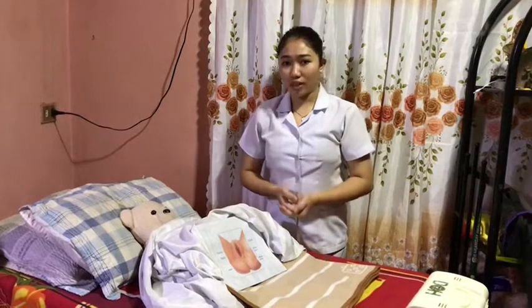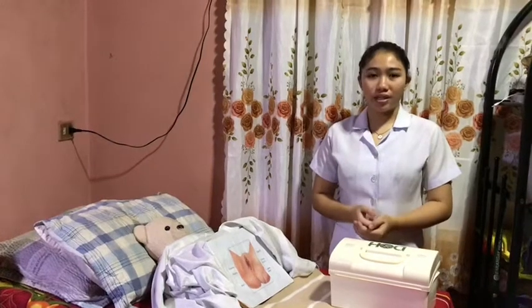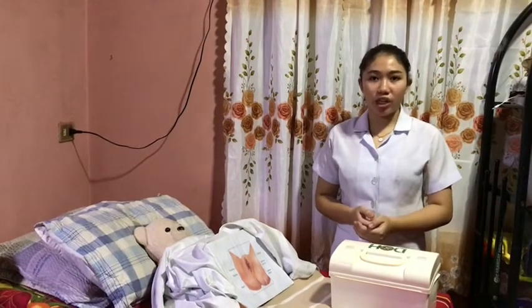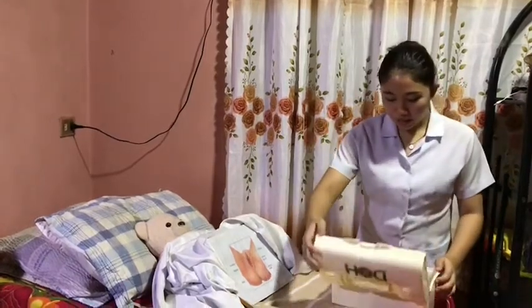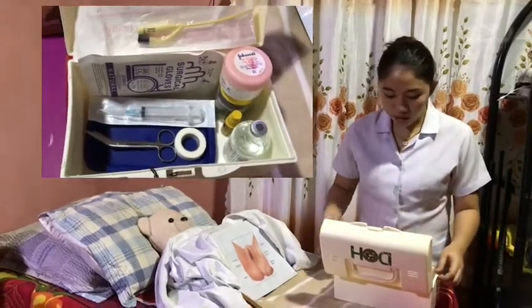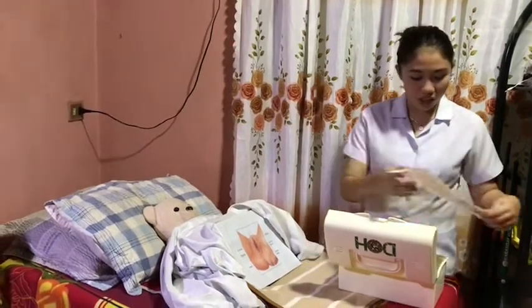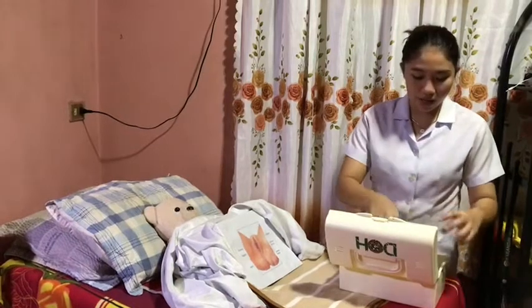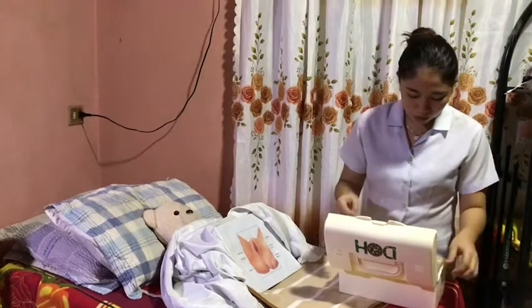Alright. Now, apply direct light for better visualization of the genital area. We're going to open the tray and arrange the equipment for convenience and to avoid contamination of the sterile items. I have here a lubricant, a sterile forceps, sterile water, sterile gloves, and a two-way Foley catheter, and I have a 10cc syringe, and also a plaster.